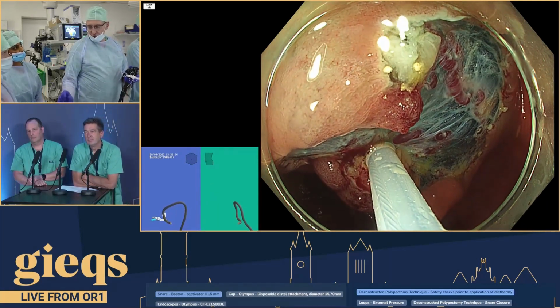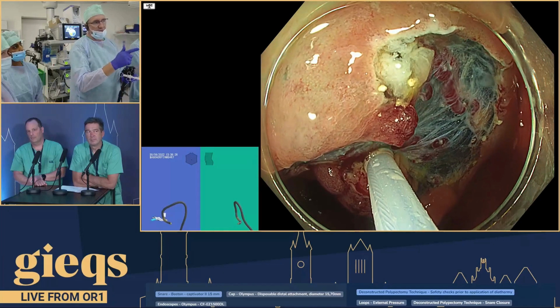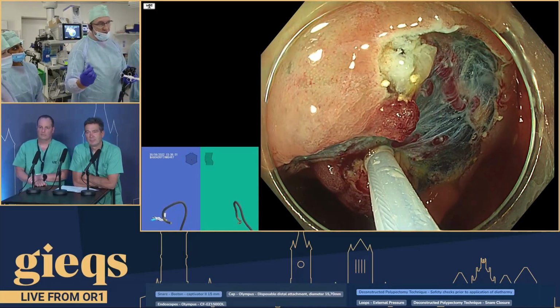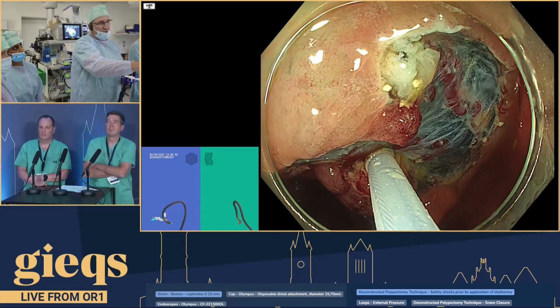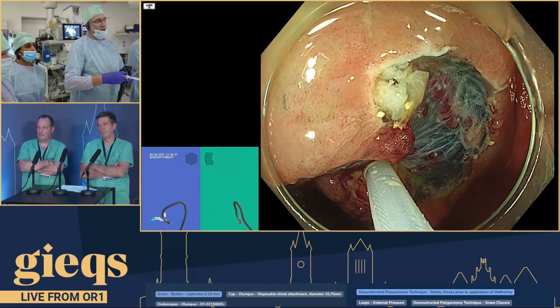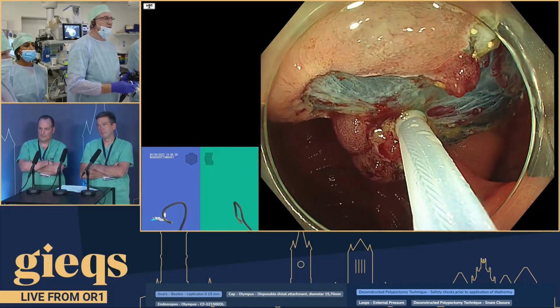What you need to do is watch your assistant's hands, not the screen. So I wasn't watching the screen, I was watching Evie's hands, and I could see that she closed to resistance, and I had the snare in perfect position, so we didn't have to watch the snare close, just see it start to close, and then we get into this position like this.